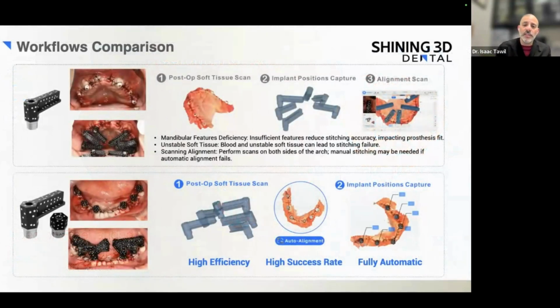We can go through the workflow for the scan matching if you want. But I suggest for surgery, and only for surgery, to use the CAP scan body solution. The CAP scan body has to be erased from the software. You have to boolean it out. So it's better to use this in a non-healed ridge. In a healed ridge, I'd rather use the scan matching above. But in a surgery, I like to use the CAP scan body. It makes it very easy.